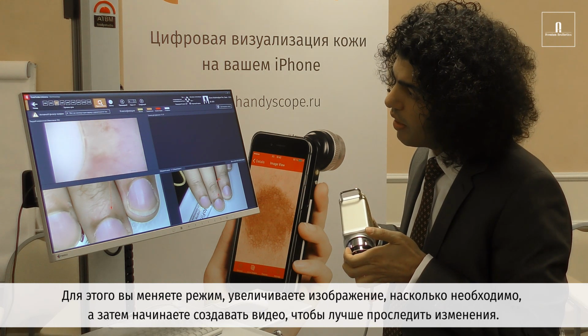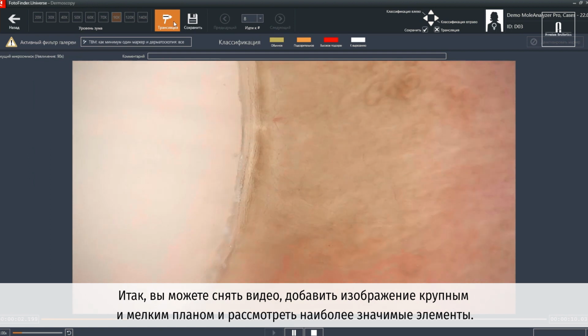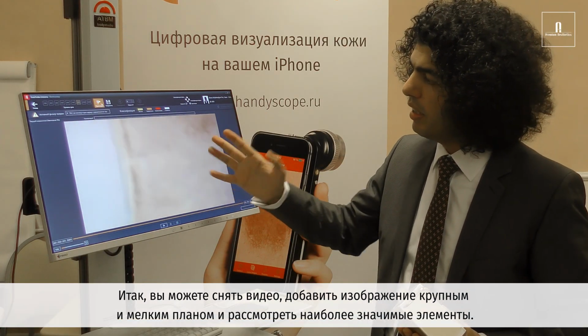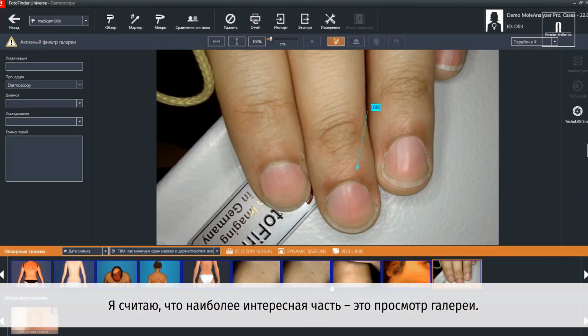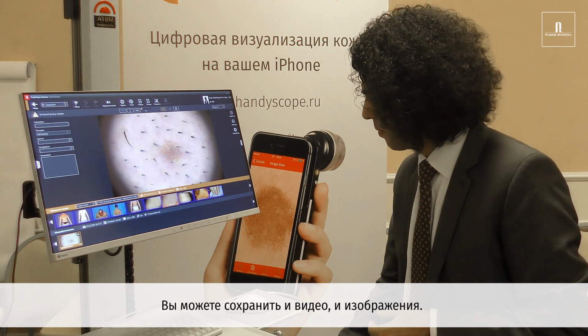the changes of this. So you are able to take a video, to zoom in and discover relevant things. So you see, this is a video that now I took. So you can take a sequence and zoom in and zoom out to discover relevant things. So in my opinion, the interesting part is there when you see in the gallery. You can save videos, and at the same time you can save pictures. Good.